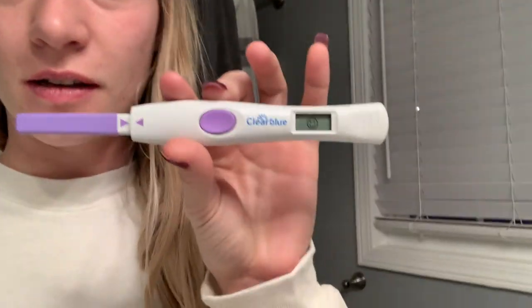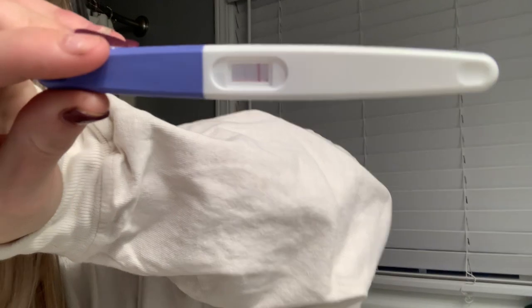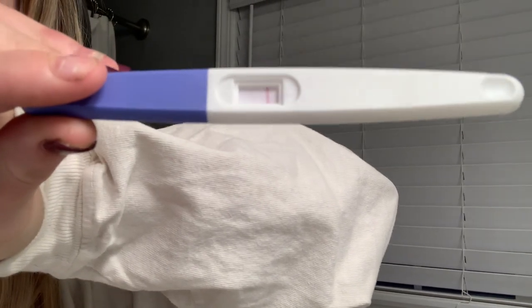Hey guys, good morning. I am testing for ovulation with the first morning urine, which I never do. I never really get good results, but I've been waiting for so long that I'm testing almost every time I go to the bathroom right now. Still got high fertility here. This one's not, it's dry, not completely. It'll get a little bit darker like it has been. And last.